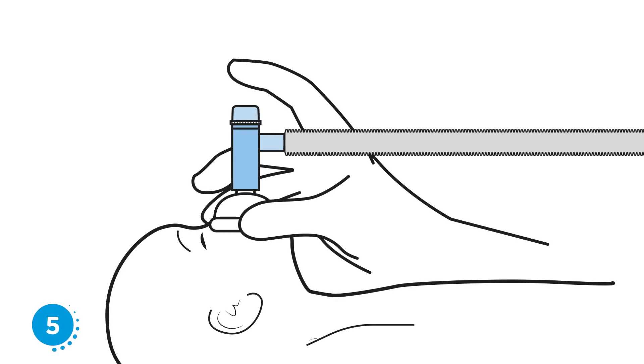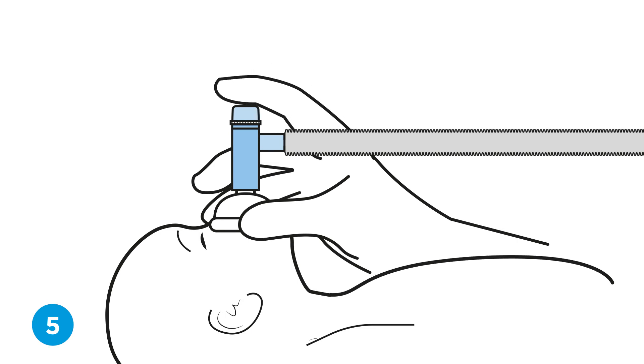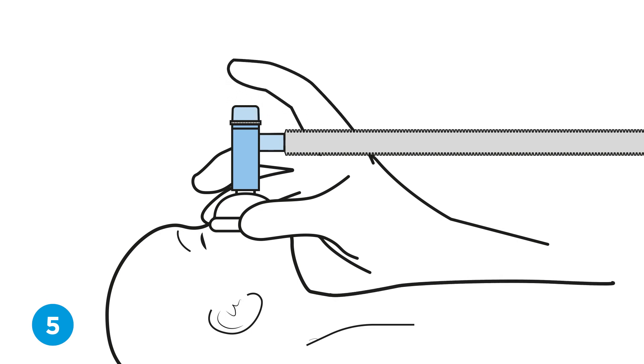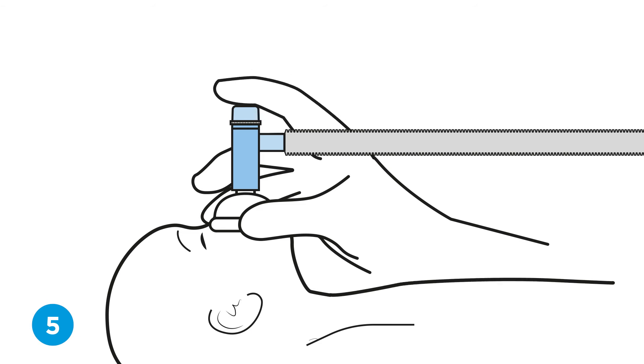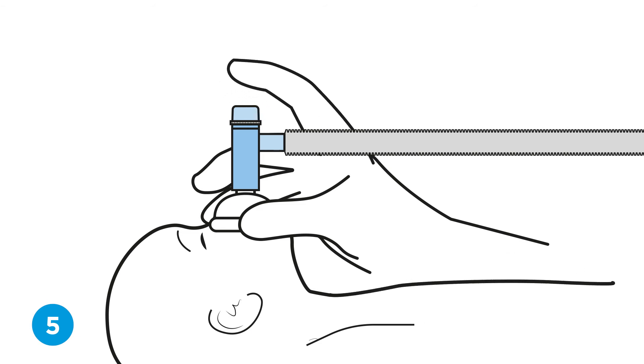Step five, resuscitation. Resuscitate by placing and removing the thumb or index finger over the PEEP valve ports at the top of the T-piece to allow inspiration and expiration at the desired breath rate.